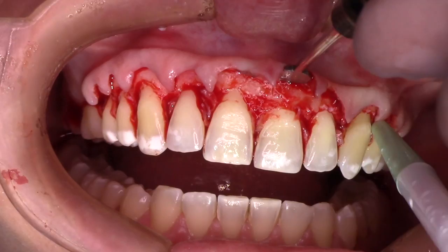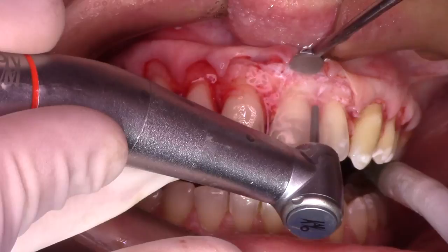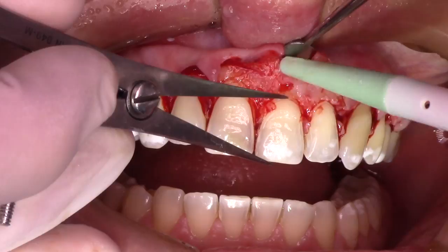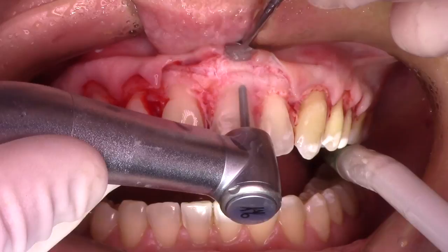Just as we change the beveling of the incision for each patient according to the thickness of their biotype, we also change how much bone we take, creating different biological widths for different patients — customizing it. For thicker biotypes, we leave about three millimeters. For very thin biotypes, we leave about two millimeters, measured from the top of the crest to the new gingival margin.